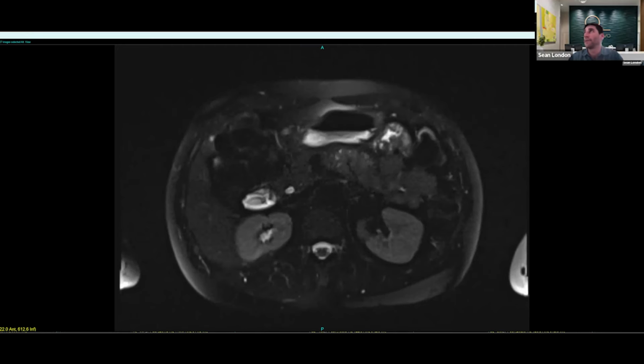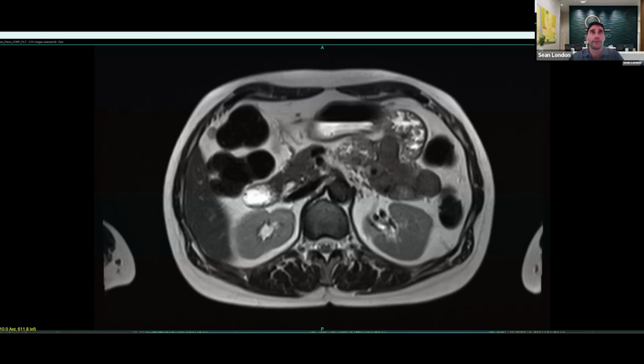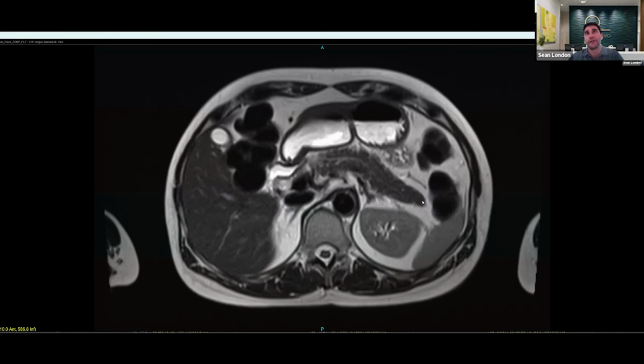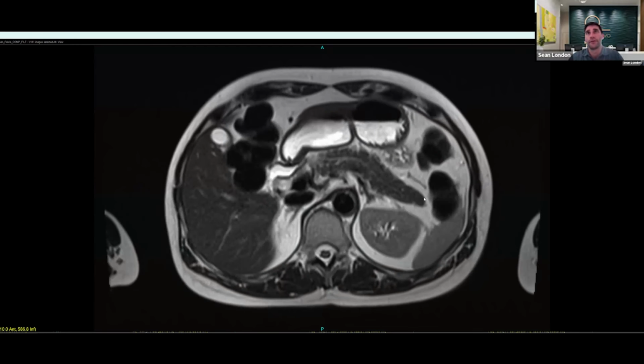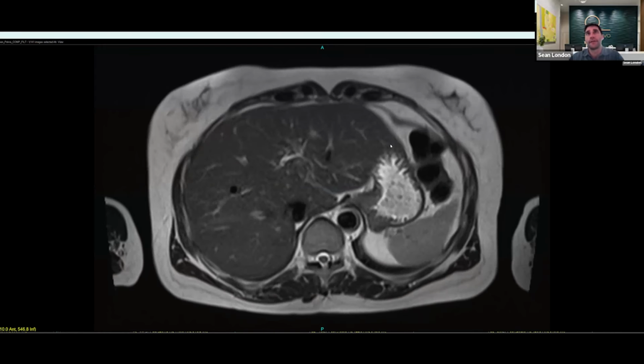Then I look at the pancreas on multiple image sets to make sure that it has normal signal and that there are no subtle masses in here. I didn't see any, but just to show you what it looks like on the main sequence that we look at, this is the pancreatic head, this is the neck, body, and tail, and it goes across our whole upper abdomen. This all looks very normal, so no signs of pancreatic mass or even concerning cysts. Then I keep moving on and I look at the stomach. There's a little bit of fluid in here, but that's normal. The wall looks normal thickness, so no signs of masses.